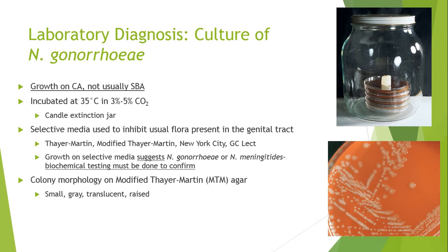and you've got your good atmosphere. Some selective media that you want to use inhibits the usual flora that's present in the genital tract. Makes your life a little bit easier to spot these pathogens. We've got your Thayer-Martin, your modified Thayer-Martin, New York City agar, GC-Lect agar.